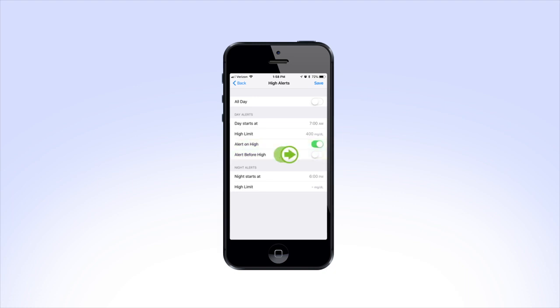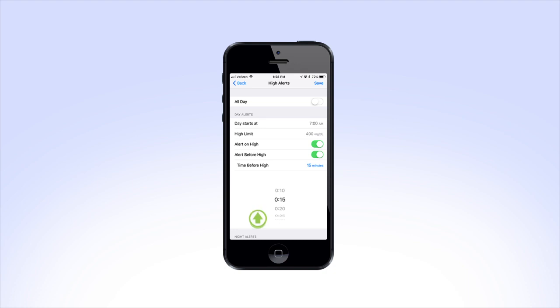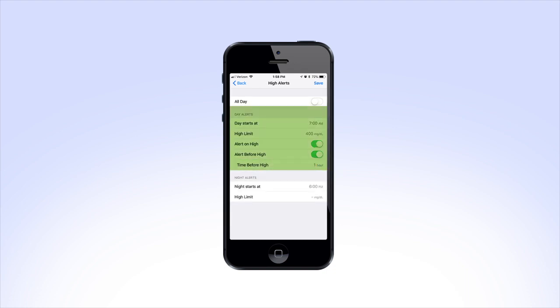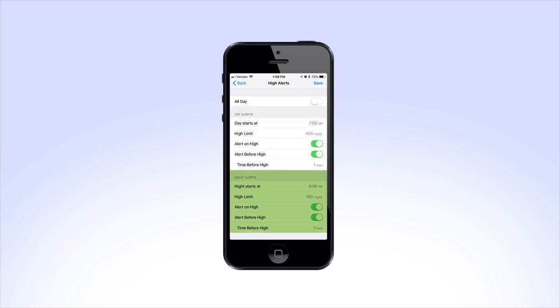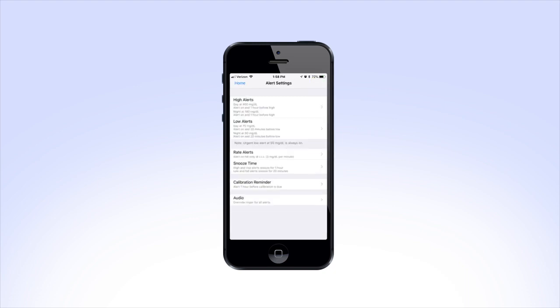Now you can select what type of high alert you'd like to receive when you reach the high limit. To select an alert, use the slider to turn it on. If you choose to be alerted before you reach the high limit by turning on Alert Before High, you will also need to set the time before high. Now that you have set up your Day Alerts, you can do the same for the Night Alerts down below. When you're done, press Save.